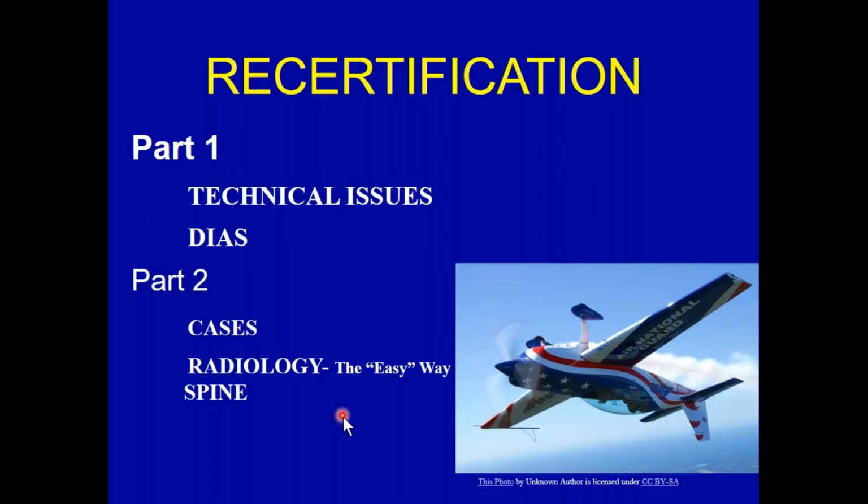Then in Part 2, we showed you some examples of underexposed, let's call them bad films, because we had surveyed some chiropractic assistants who were taking x-rays, and they said, I don't know how to change. How do I identify bad film? How do I change it? How do I make changes so it becomes diagnostic? So we showed you some examples of those particular things and how to work with that. And we worked through a series of steps, and one of them being, are you using the optimal KVP for that particular examination which you're doing?